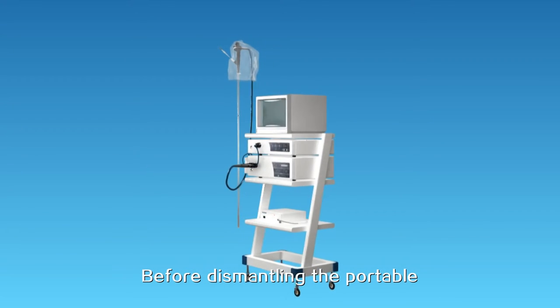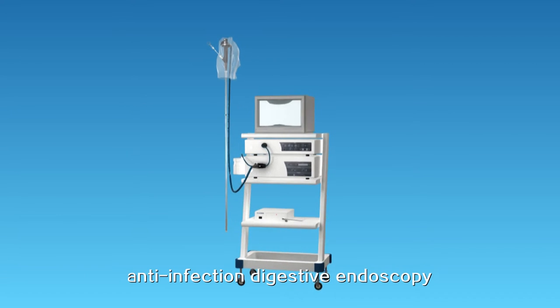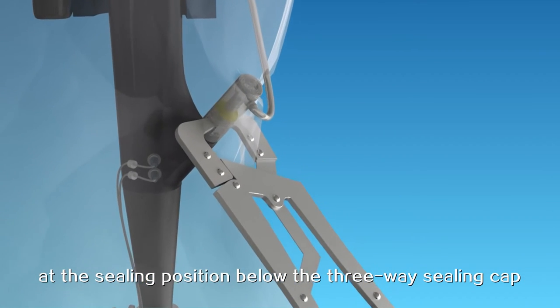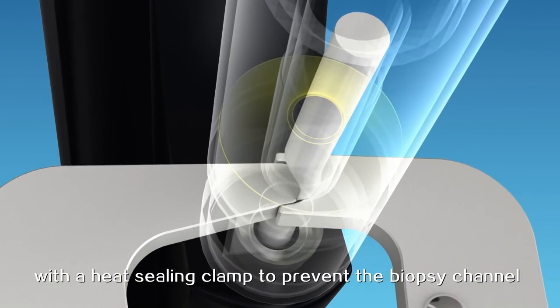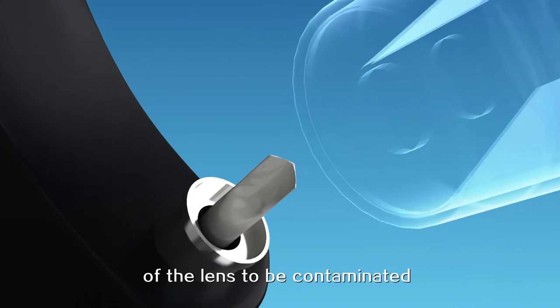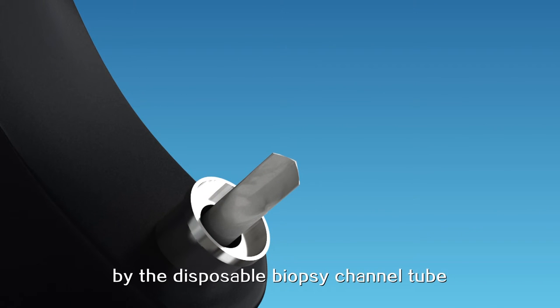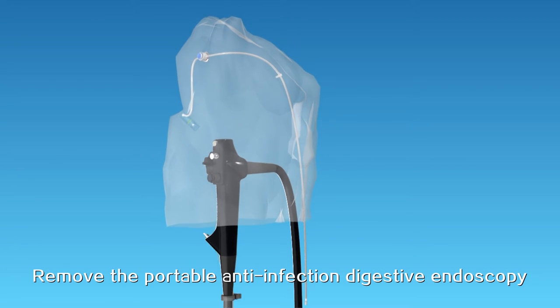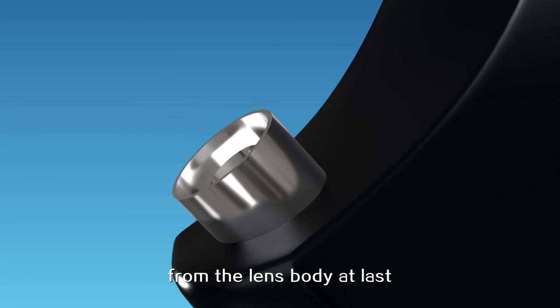Before dismantling the portable anti-infection digestive endoscopy, cut off the back end of the biopsy channel tube at the sealing position below the three-way sealing cap with a heat-sealing clamp. This prevents the biopsy channel of the lens from being contaminated by the disposable biopsy channel tube when it leaves the lens. Then remove the portable anti-infection digestive endoscopy from the lens body.